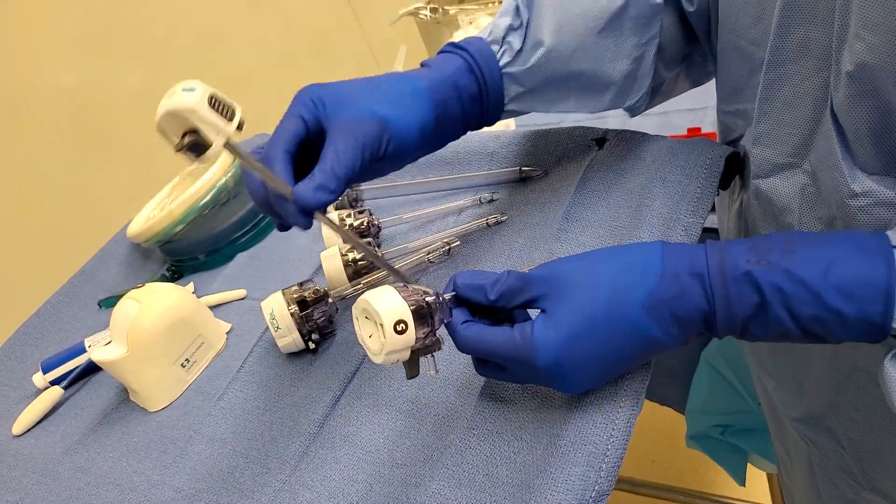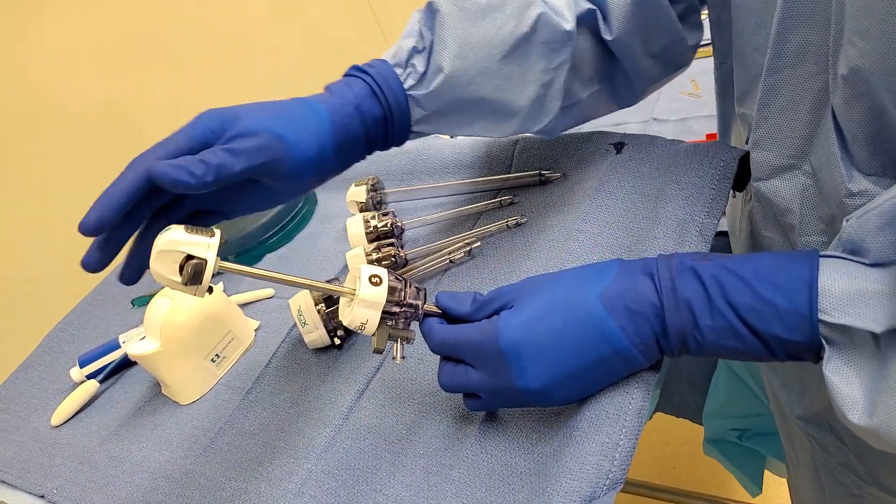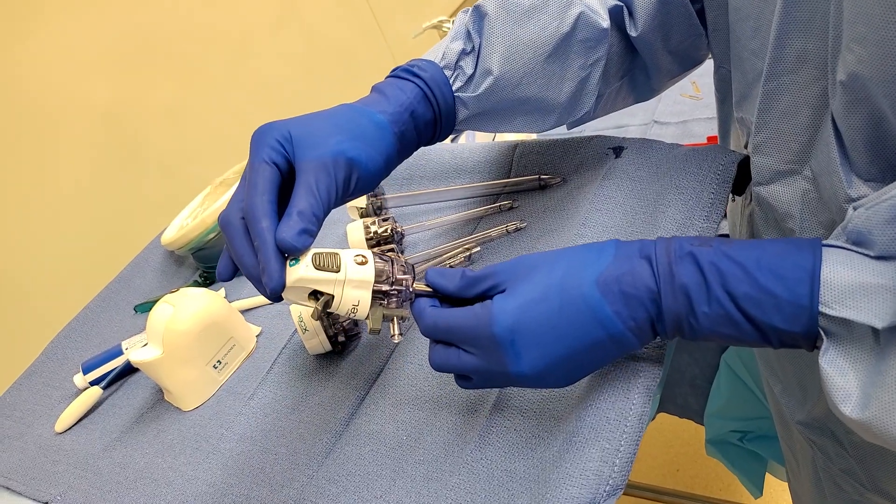This is the trocar and this is the obturator. For the 5mm, you just put them in like this and it clicks.